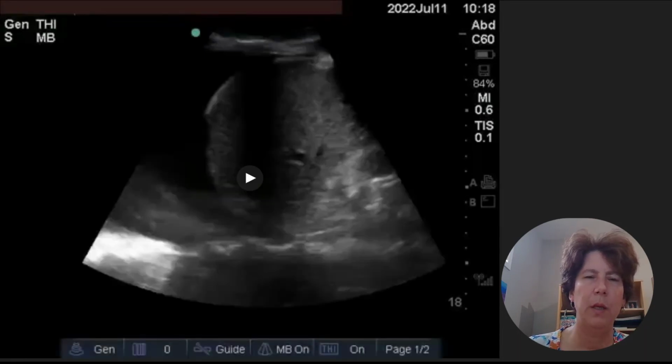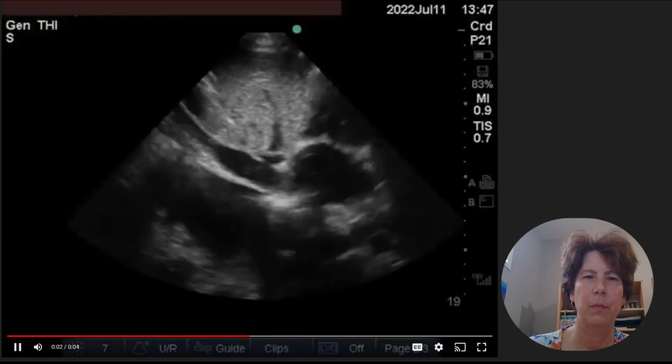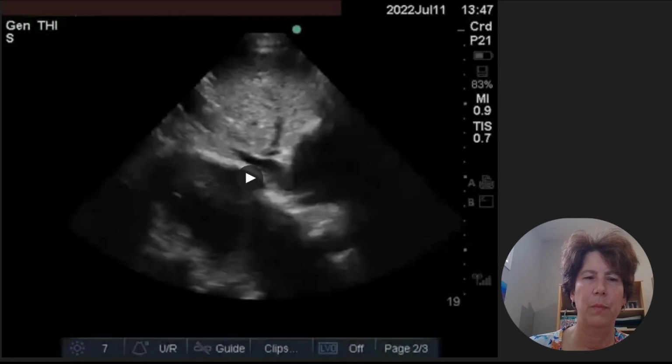Okay. Your second scenario is going to be, you've done the anesthetic, you're in the recovery room, and you're going to rescan the patient, and you will see the following. Okay, now in this recovery room, based on that IVC picture and the clinical scenario, so you've given this patient an anesthetic, blood loss was about 400, you've given 800 mils of Ringer's lactate. How would you manage this patient in recovery if their systolic was 60?